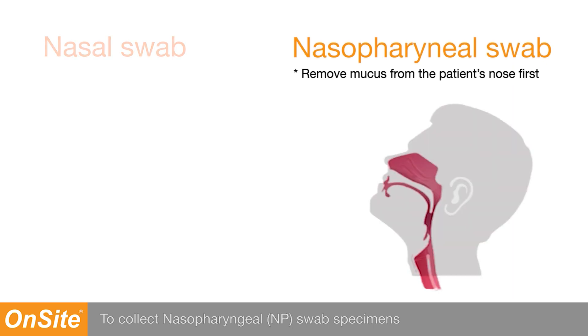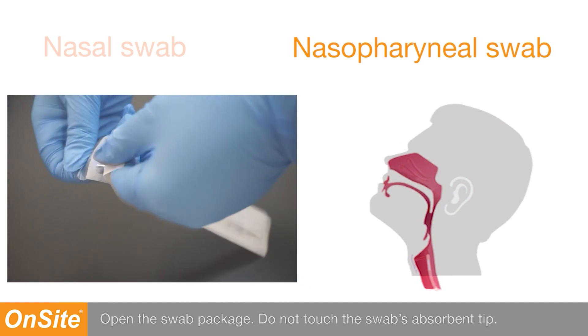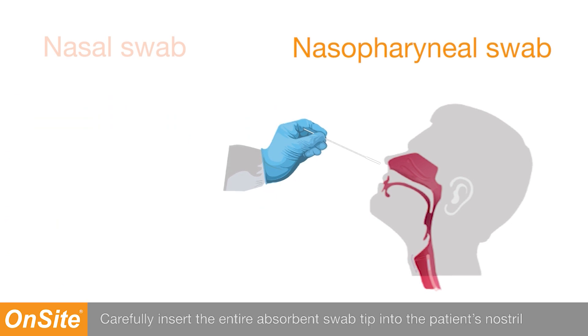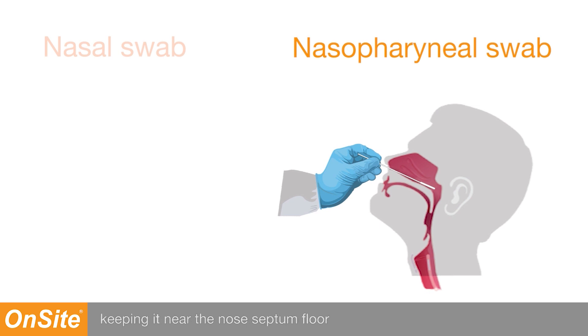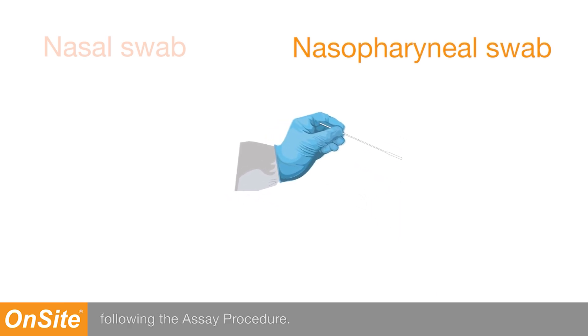To collect nasopharyngeal swab specimens, hold the patient's head in a vertical position and looking slightly upwards. Open the swab package. Do not touch the swab's absorbent tip. Carefully insert the entire absorbent swab tip into the patient's nostril that presents the most secretion, keeping it near the nose septum floor while gently pushing into the posterior nasal pharynx. Rotate the swab at least five times. Withdraw the swab from the nasal cavity. Proceed to specimen extraction following the assay procedure.